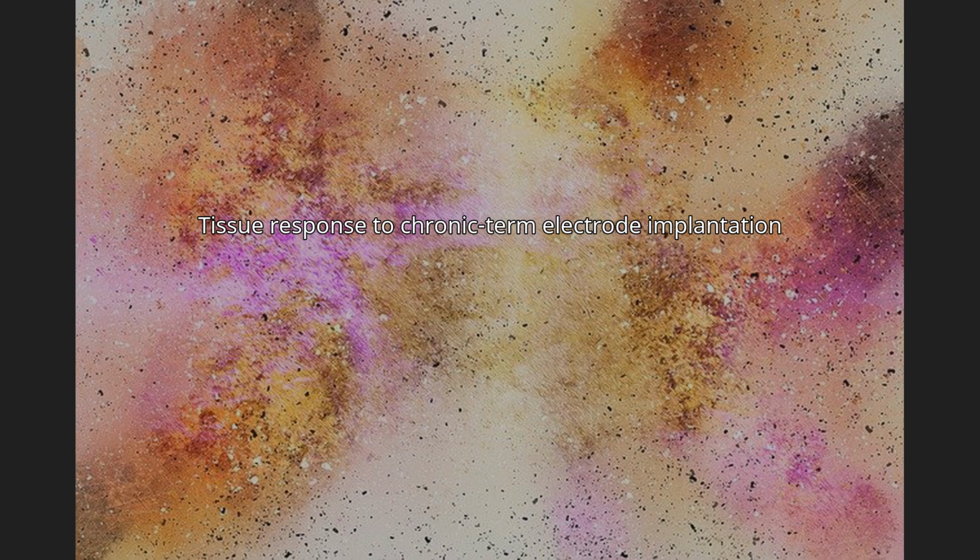Another recent study addressing the impact of chronically implanted electrodes points out that tungsten-coated electrodes seem to be well tolerated by the nervous tissue, inducing a small and circumscribed inflammatory response only in the vicinity of the implant, associated with a small cell death.